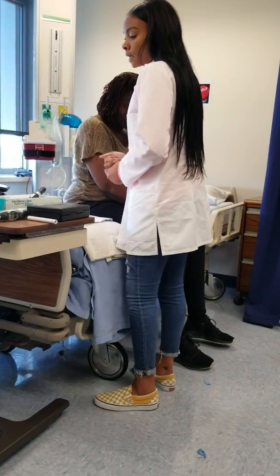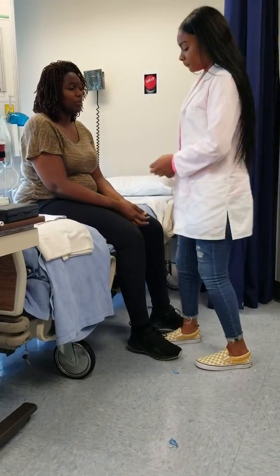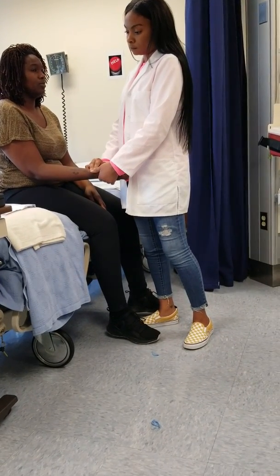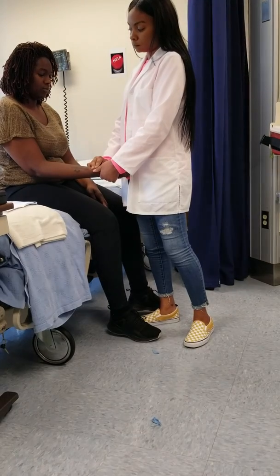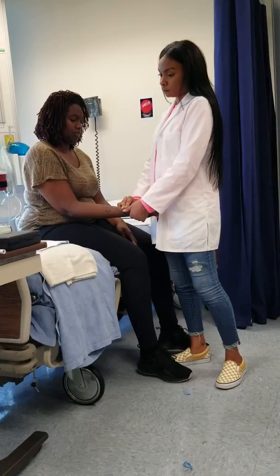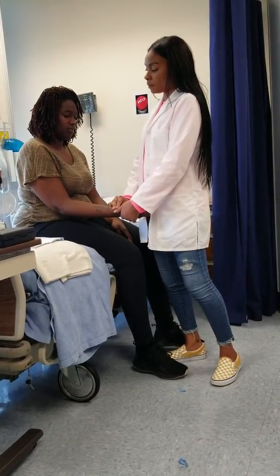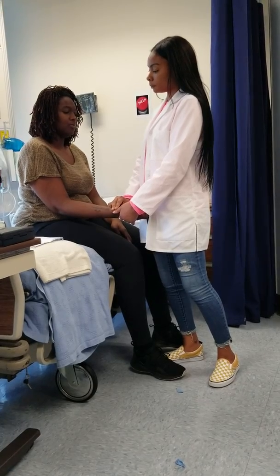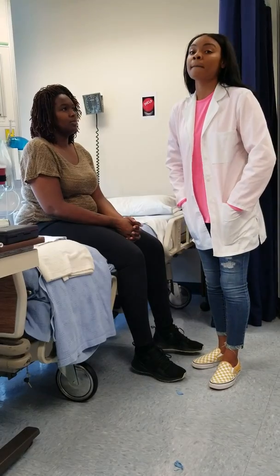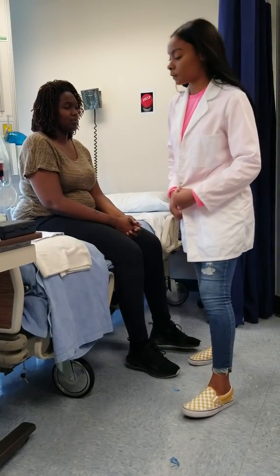So I'm gonna start by taking your vitals. I'm gonna start with taking your pulse, okay? Okay. Okay, great. Your pulse is a 72. And as I assess her pulse, I also assess her respirations, but you do not want to let the patient know that you are assessing their respirations as you are doing it.